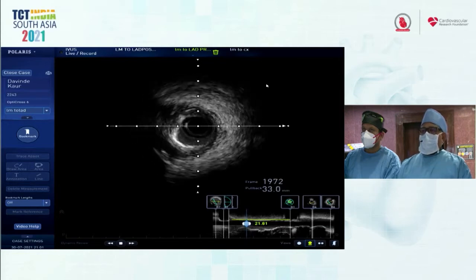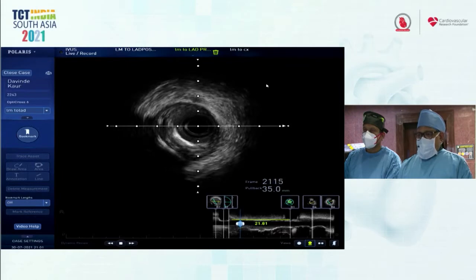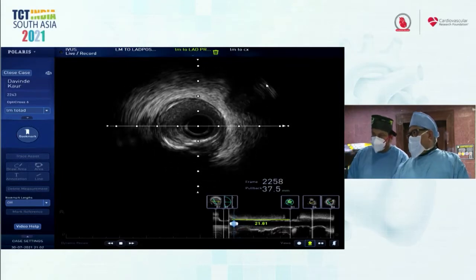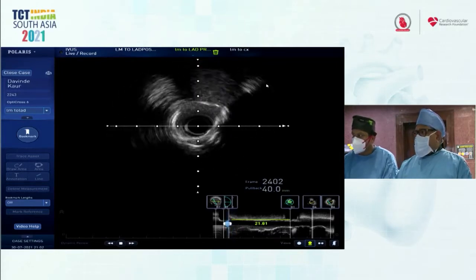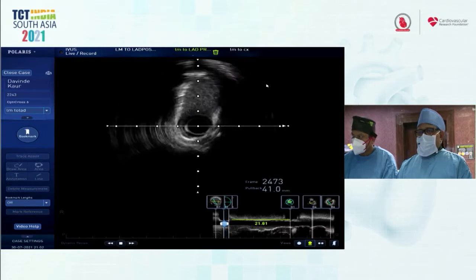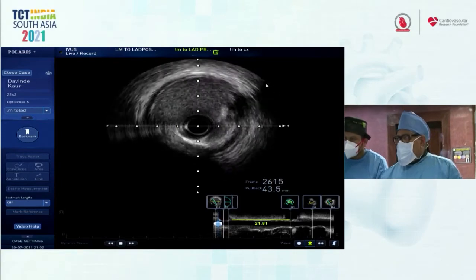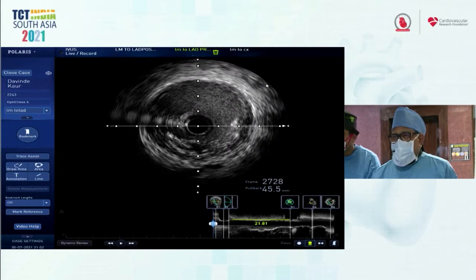So I think you have to differentiate between deciding whether to treat and deciding how to treat. If you're deciding whether or not to treat, then you really should rely on FFR or physiology, period. At least, except for the left main, in which I think imaging is probably as good or better. But I don't really care what the lumen area is in the LAD and the circumflex. If physiology is above the ischemic threshold, leave it alone.